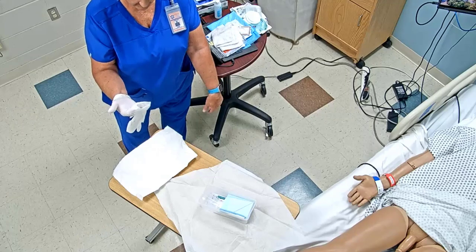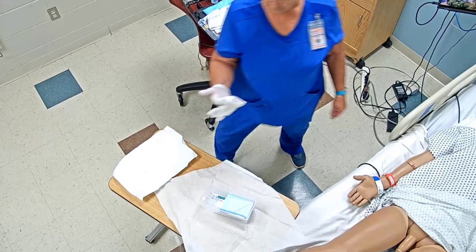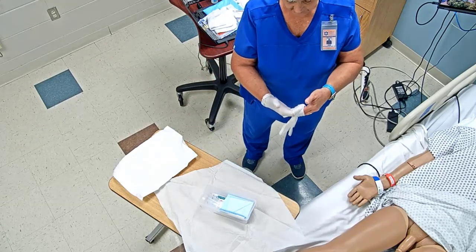Okay, so once I've got my fingers underneath the cuff, you want to make sure you have your glove thumb up at all times.